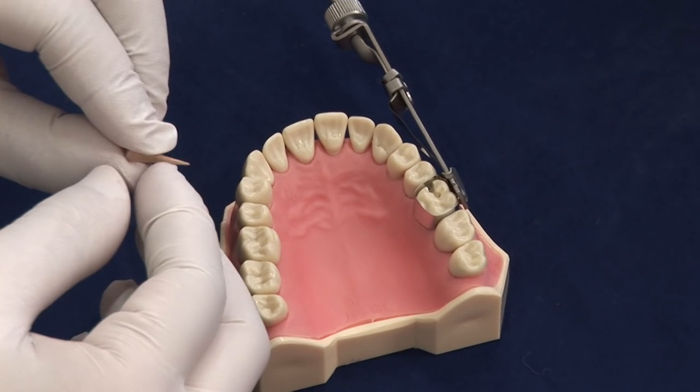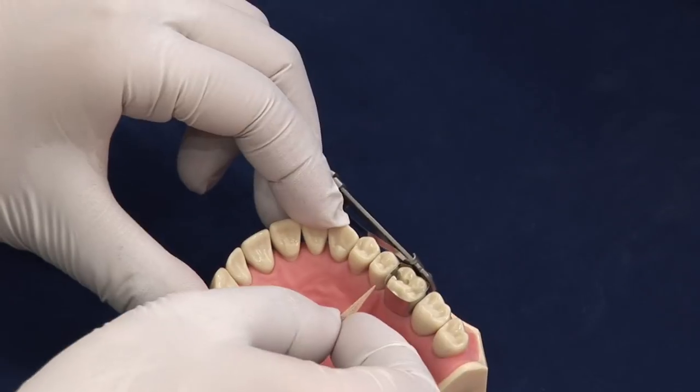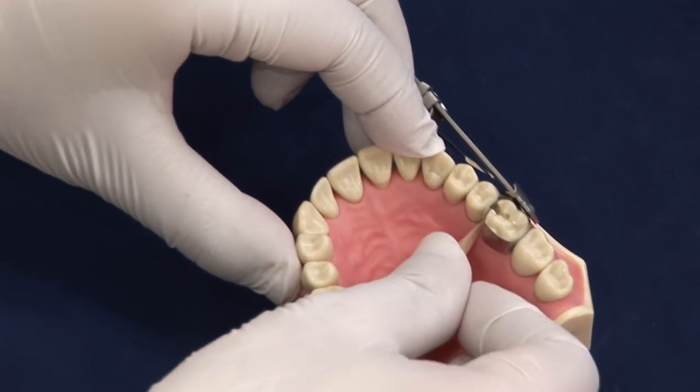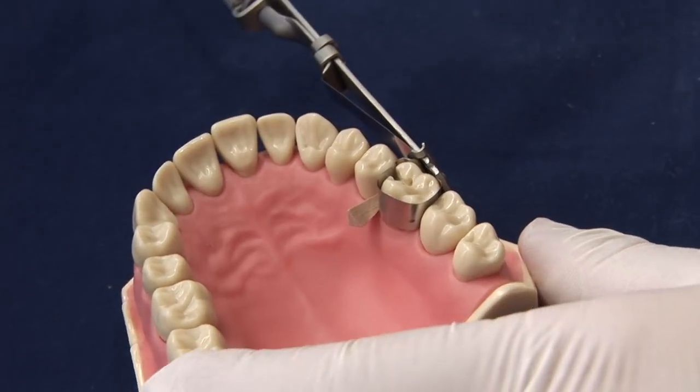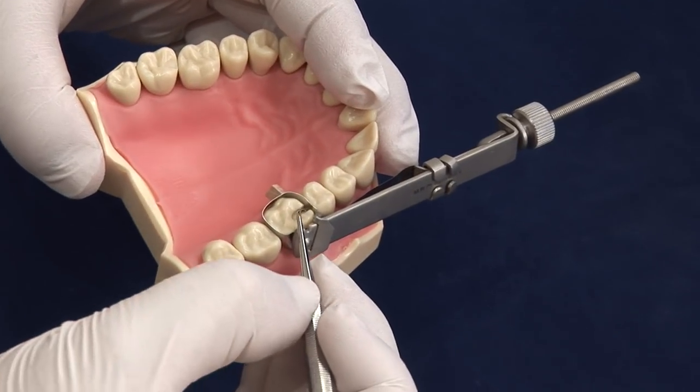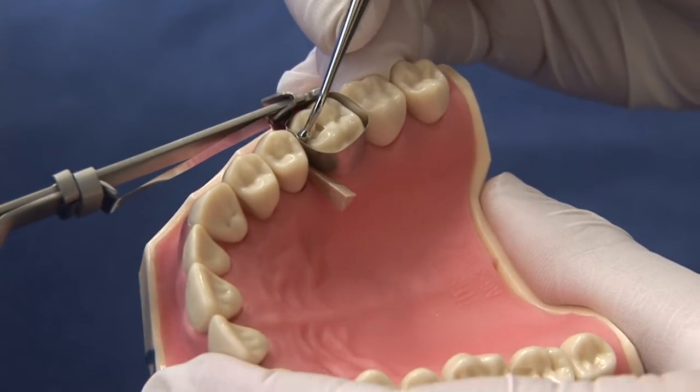To hold the matrix band in place, insert a wooden wedge in between the tooth. Push in place with the back of a pair of tweezers. To adapt the matrix band to the neighbouring tooth, use a ball burnisher.